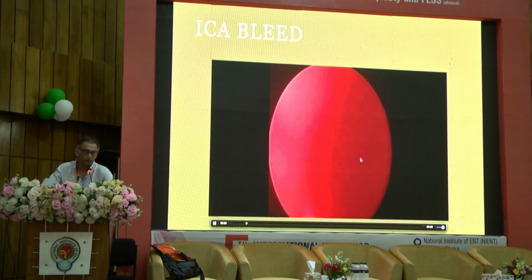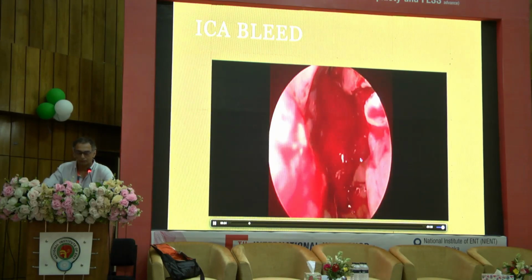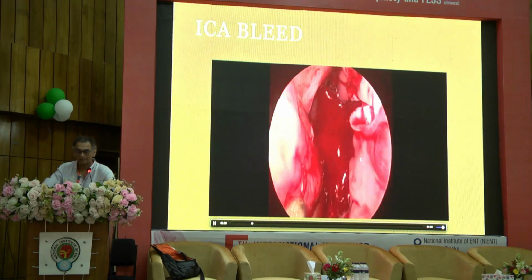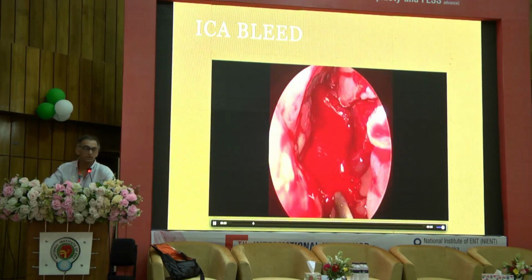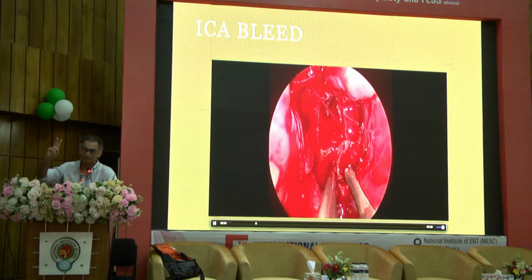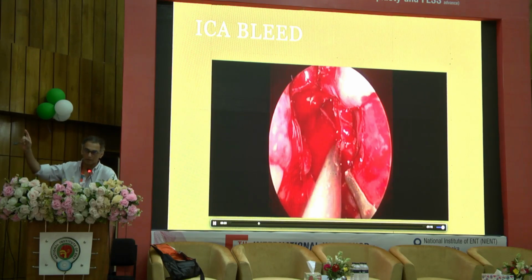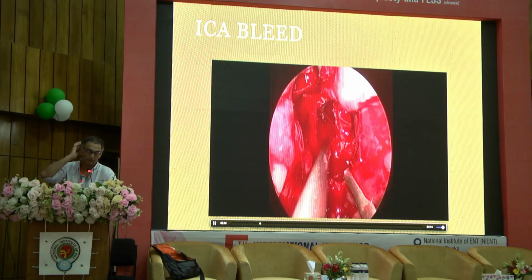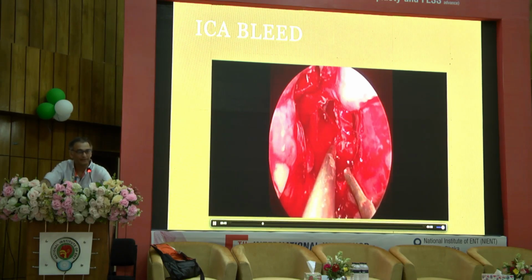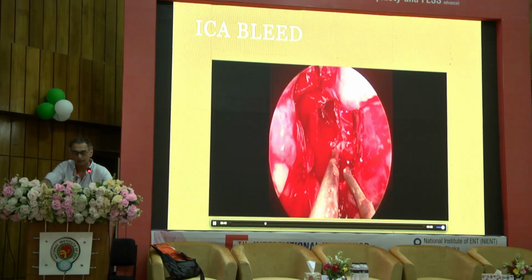With a puncture. Again, fortunately, it's a two-surgeon, four-hand technique. So you have an additional person. The first thing you need to do is to localize where the bleeding is. Actually, the first thing is to tell the anesthetist you've got a carotid. So they are infusing fluid, pushing in fluids. You don't want the BP to drop. You want to maintain blood pressure. They need to get someone to ask for blood, 3-4 bottles, whatever. And then you localize.